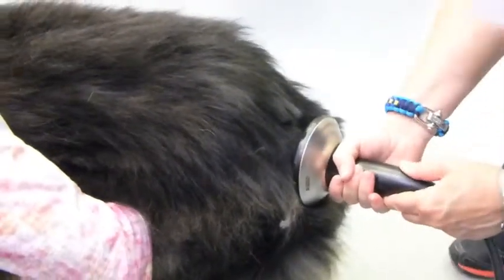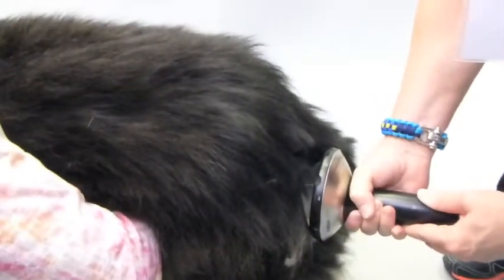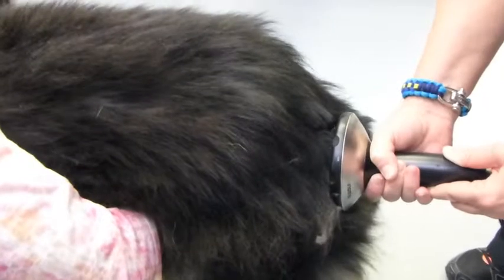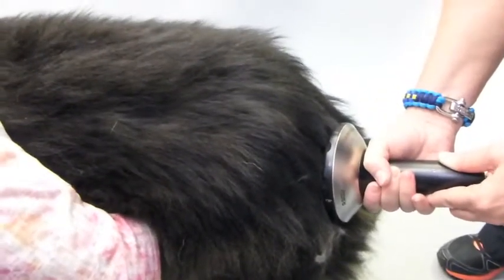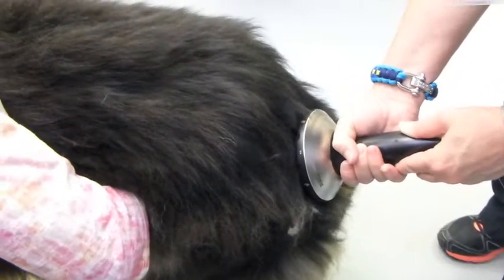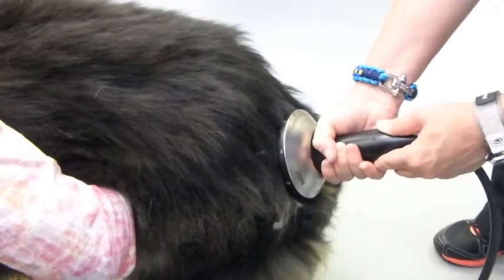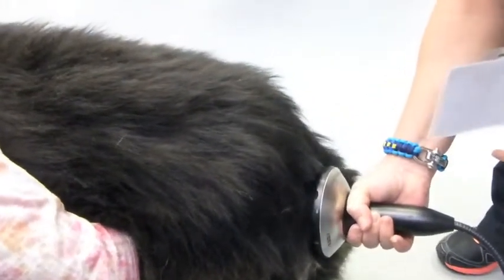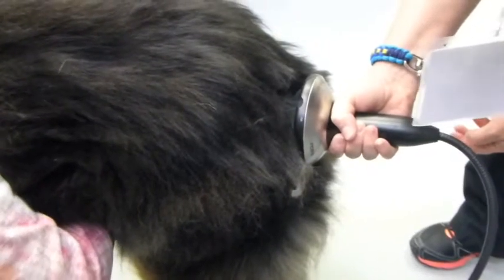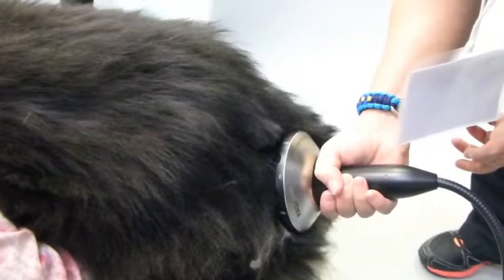I increased it to 8 hertz. I think we ought to stop right there — he's still actually more interested in the noises. So he's at level 6, and you don't necessarily want to make them uncomfortable. When you were taking your finger off the probe, just to the point where... We've got about another 100 more to do, or do 750.